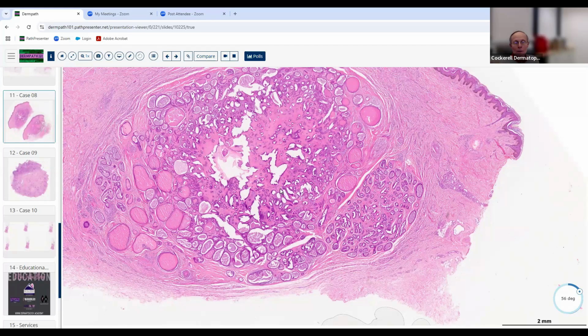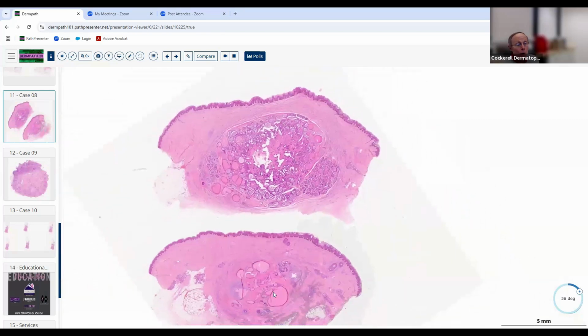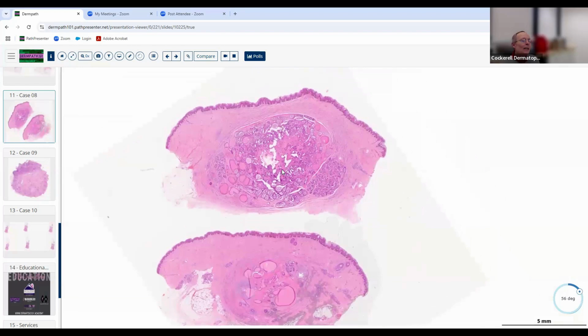So don't choose that. That's getting a little tricky, but they might say, we want the best diagnosis here, and we don't want someone to choose the wrong diagnosis when it's really better to call this a tubular apocrine adenoma, because it's a perfect example. So they're going to show you something like this. It's a little bit weird. It's going to be a textbook, beautiful case of it.